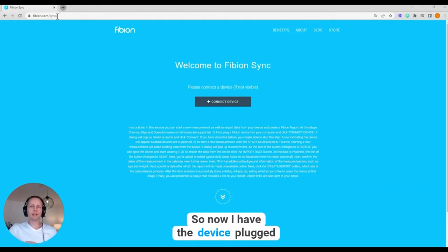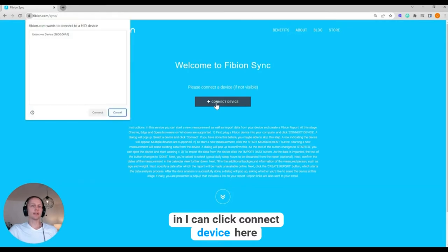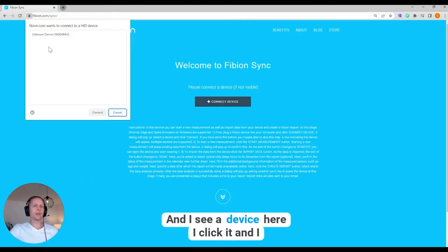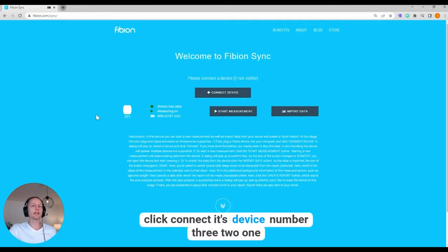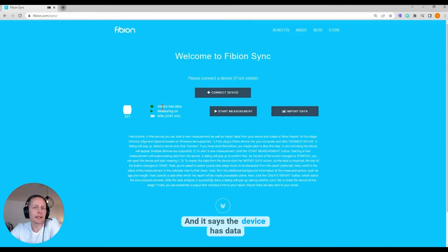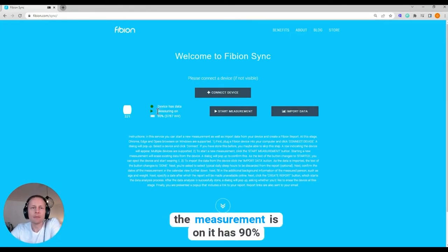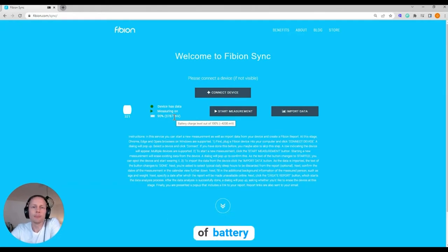So now I have the device plugged in, I can click connect device here. And I see a device here, I click it and I click connect. It's device number 321 and it says that device has data, the measurement is on, it has 90% of battery.